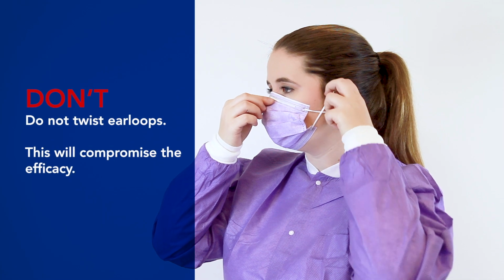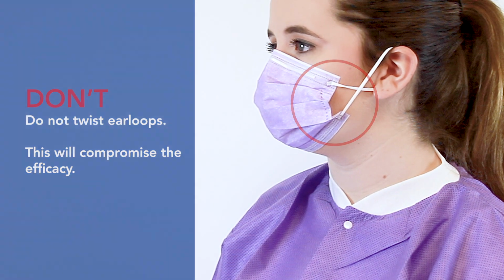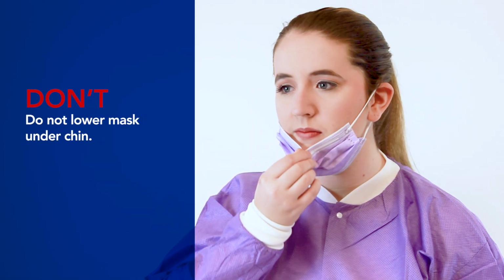Do not twist the ear loops. This will compromise the efficacy of the mask. For maximum efficacy, do not lower the mask under your chin.